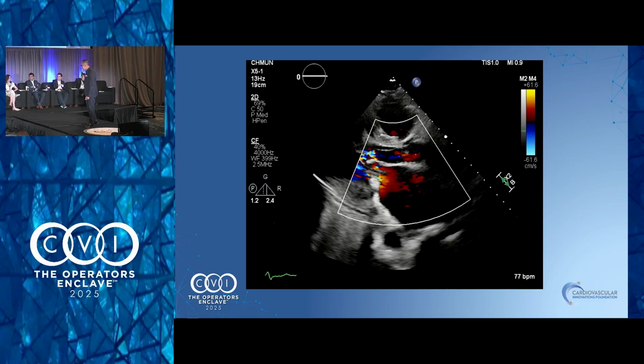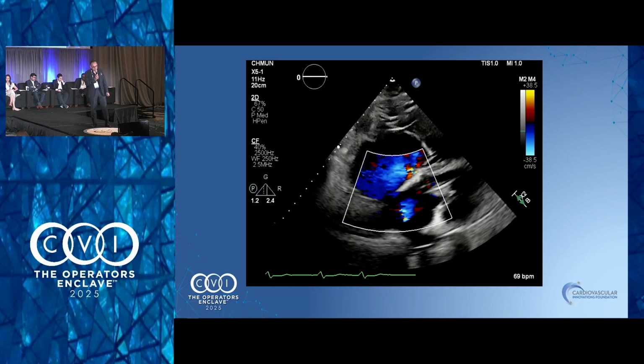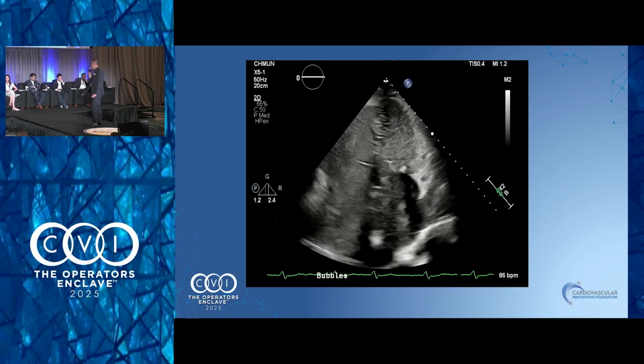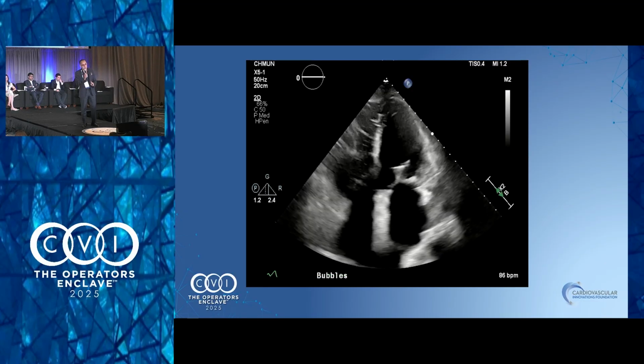Right. So anyway, we get an echo. I think this is a decent result, but this is what I'm dealing with now. And obviously, we have a septal defect from my transseptal access. I'll tell you, there are a lot of procedures we do as interventionalists that are very satisfying. This was one of the most incredible.